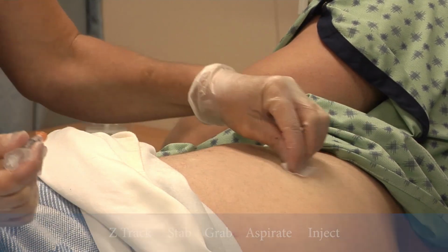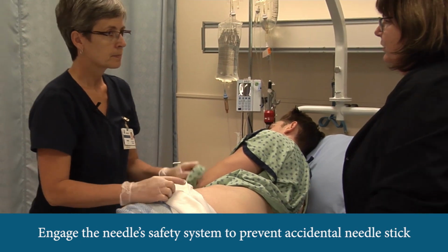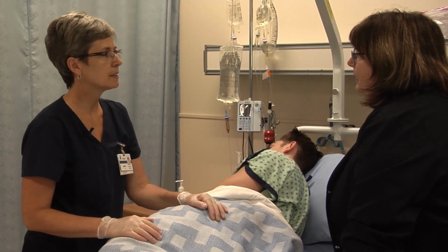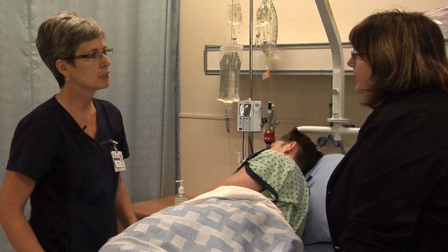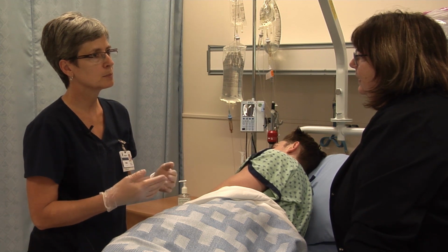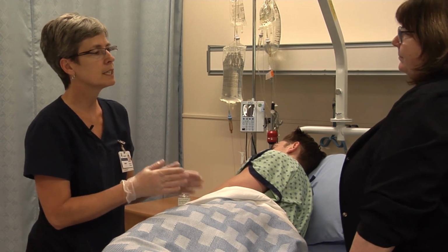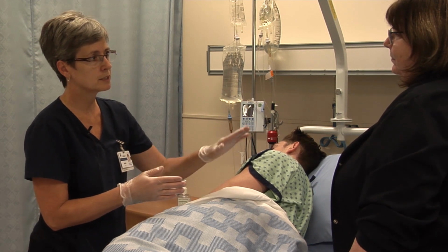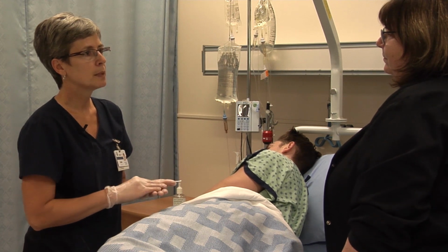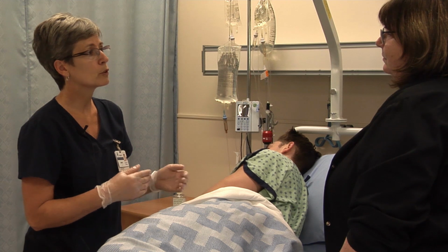Okay. And then pull up. So is there a sequence, like when you go to pull out, can you let go of your Z track? Or do you do it all at the same time? Really good question. I haven't given an IM injection for a long time because they are sort of fading away. Where we see IM injections most of the time is in flu clinics, but flu clinics don't Z track. And in flu clinics, or anytime they give immunizations, they don't aspirate because there's a different body of research. I think aspiration is one of those controversial things right now that we may see go the way of the dodo bird in the future, because even the literature is inconsistent on whether or not we should be aspirating.